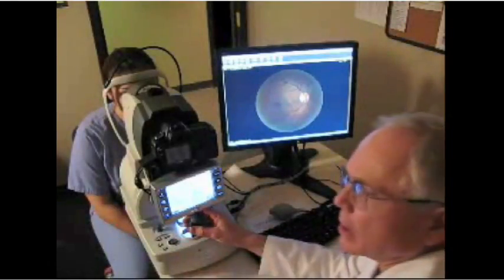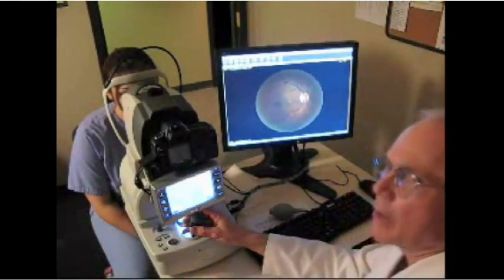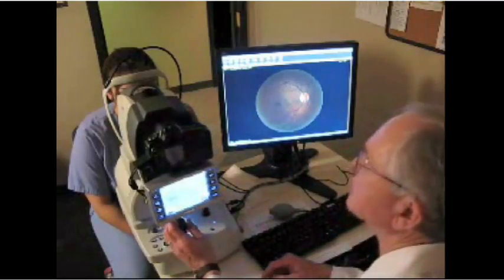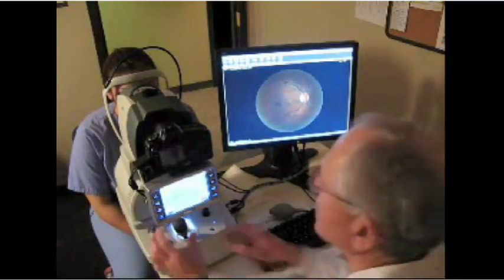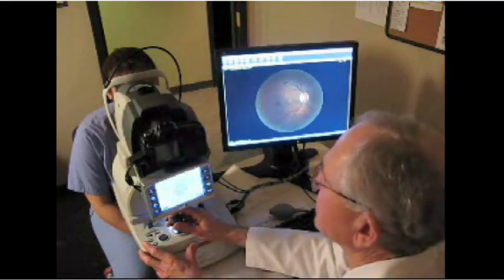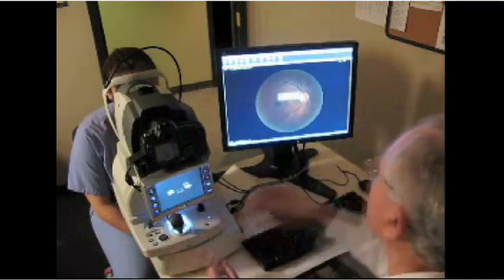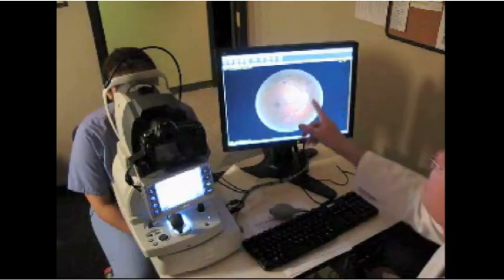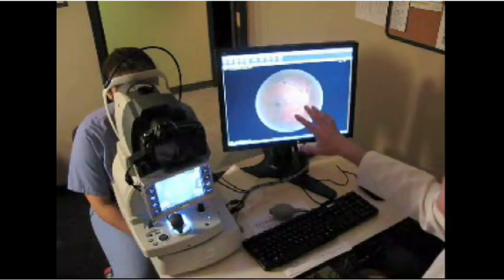This is a small pupil fundus camera and I'm going to demonstrate how easy it is to use on Judy, one of my technicians — and Judy has not had any dilating drops. So all you do is line up the camera, it's self-focusing, gets lined up like that, take the picture, and there is her retina through an undilated pupil.